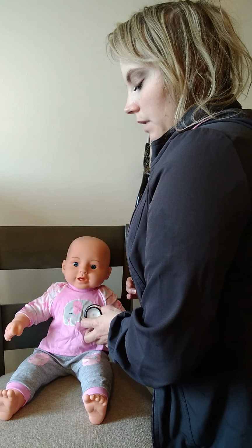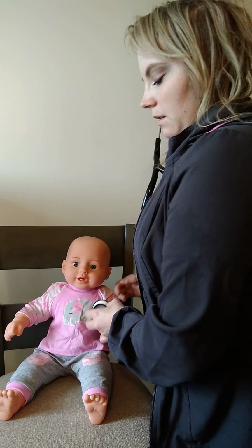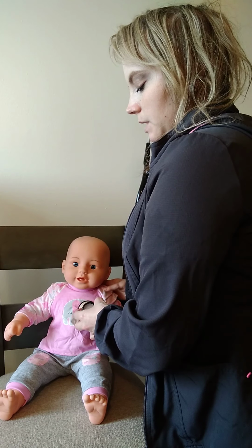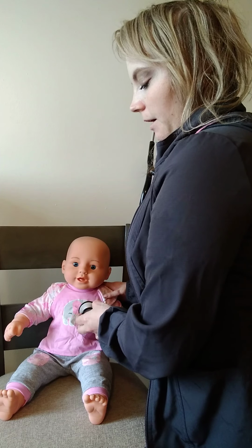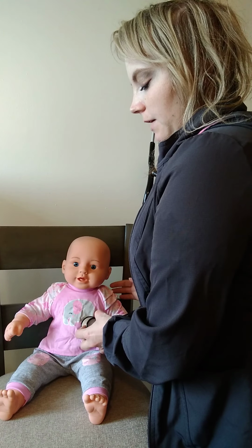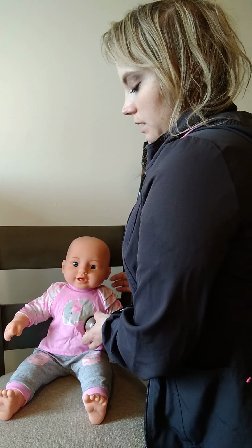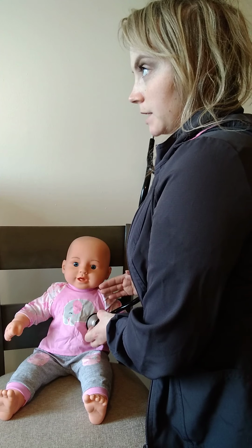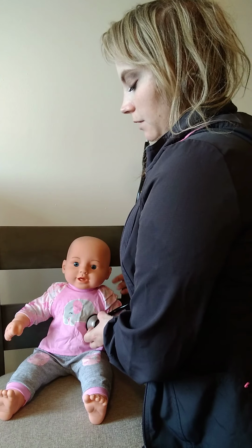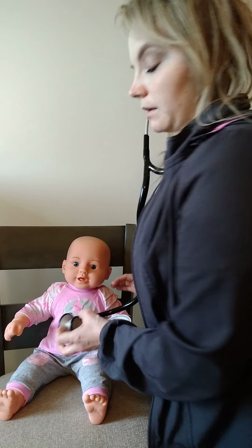Then we're going to go down to the fourth intercostal space here. Okay, now the fifth intercostal space, mid-clavicular line, we're going to listen for. And it all sounds normal.